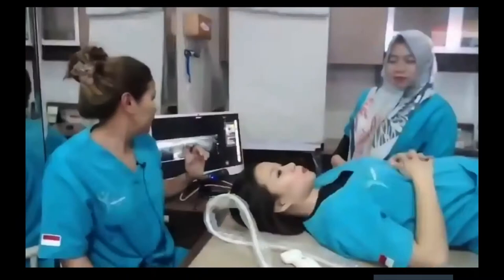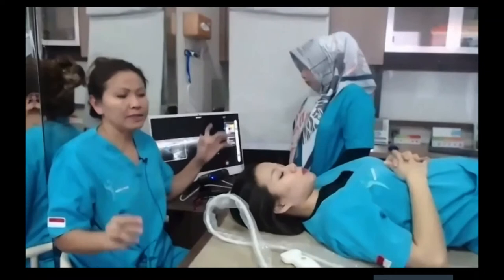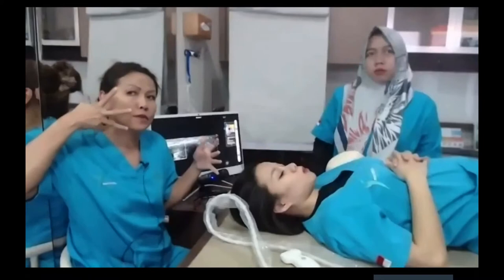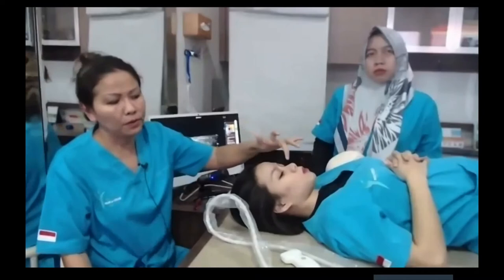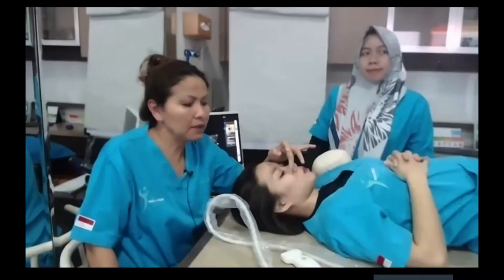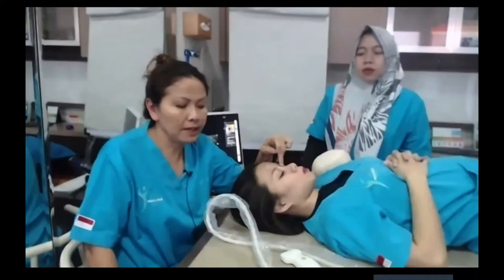Okay. And the second one is the infraorbital nerve block. It is used for me, if I don't want to use the fluoroscope, I can use it to treat the V2 involvement of trigeminal neuralgia, which the superficial branch is the infraorbital nerve, which comes out from the infraorbital foramen here, just about 1.5 centimeters below the eye here, more or less 2 centimeters from the midline. Okay, so all is in this line.